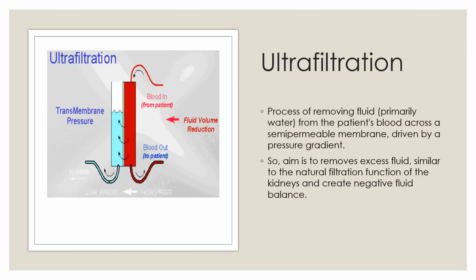In renal replacement therapy, ultrafiltration is the process of removing excess water across a semi-permeable membrane driven by a pressure gradient. This is similar to how the kidney naturally filters fluid from the blood and makes urine. This process is used to manage fluid overload in patients with acute kidney injury or other conditions where the kidney cannot perform this function adequately. So, aim is to create negative fluid balance.